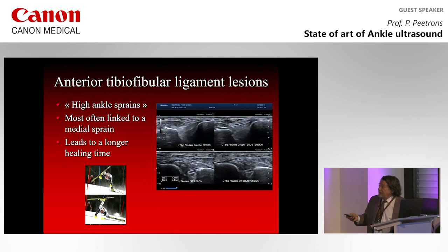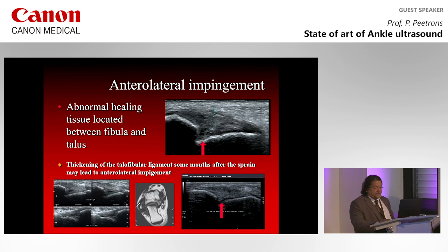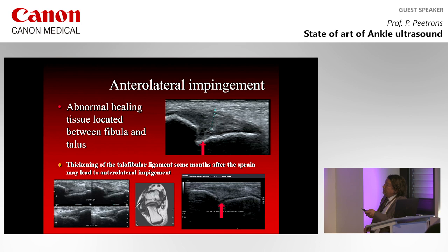And this is an example here with tension and without tension, so clearly abnormal compared with the normal one, of this inferior tibiofibular ligament injury. So we have already discussed the anterolateral impingement. This is an abnormal healing tissue located between the fibula and the talus. So thickening of the ligament, we have seen it.